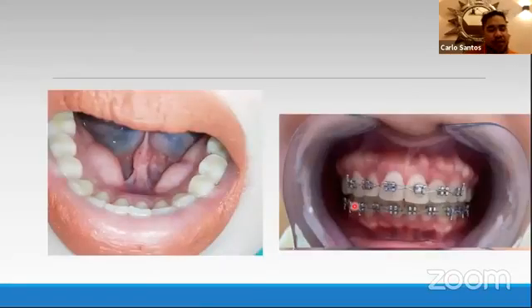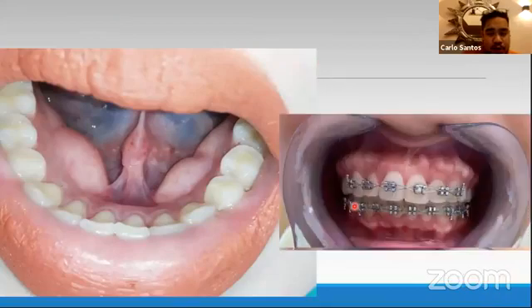All right. Another part of our oral plastic surgery lecture is of course dealing with tori and bony exostosis. Again, comparing the use of your piezo machine to using a burr, it's more precise. It's like drawing with a sharp pencil rather than chalk. Here you see the tori and the exostosis. These are procedures that are part of your oral plastic surgery, and I encourage everyone to do them.